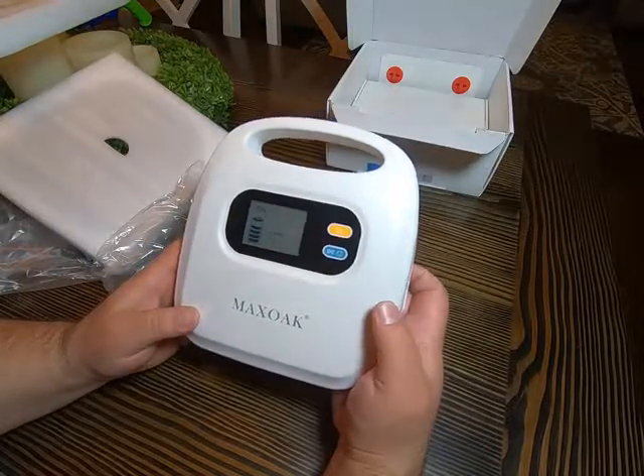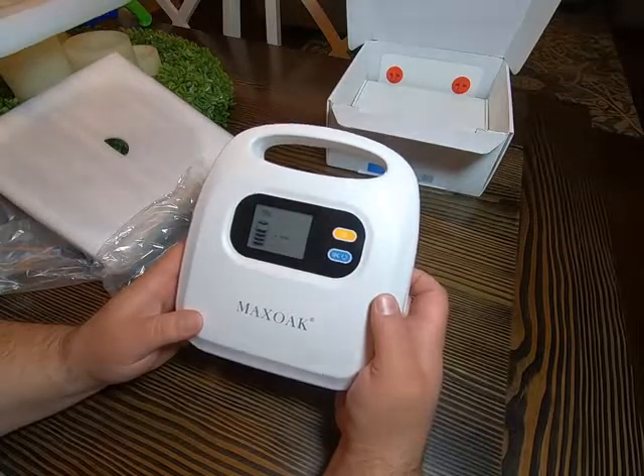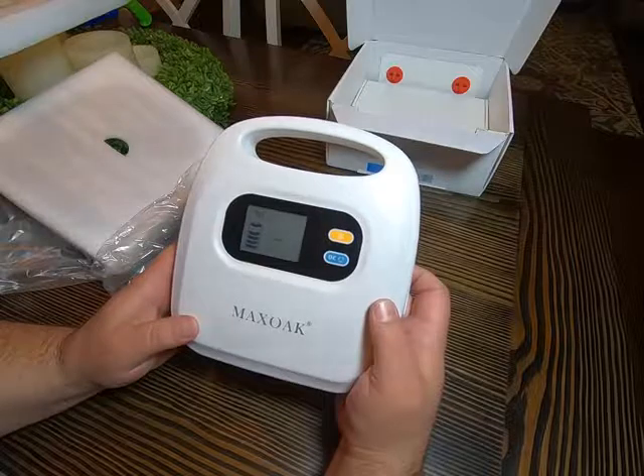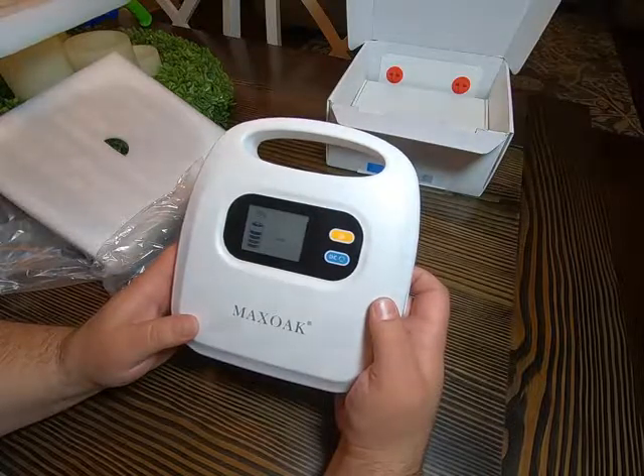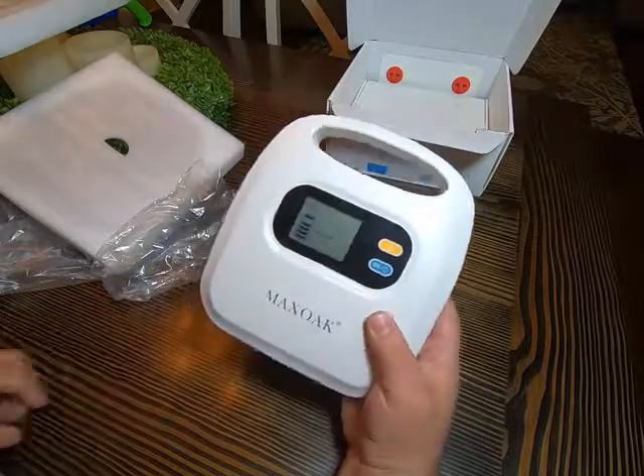Looks like it's at 79% charged. What I'm going to do, because I really want to put this through its paces and test it, is put it on the charger tonight and let it get all the way up to 100% before I start testing it — and see how many nights I can get on this. I'll go ahead and end this for now and pick back up tomorrow.